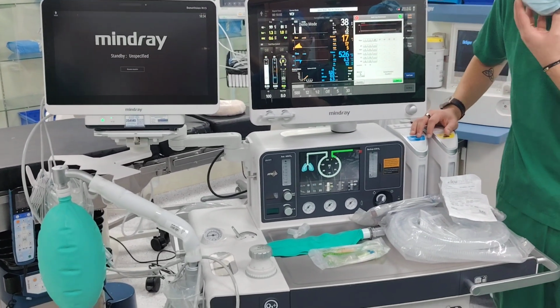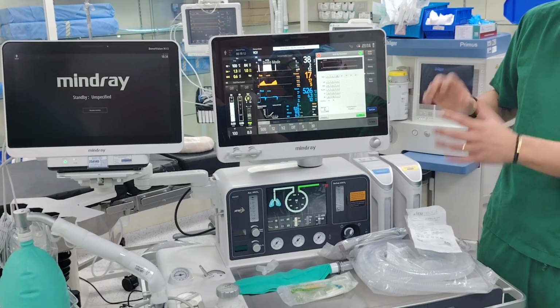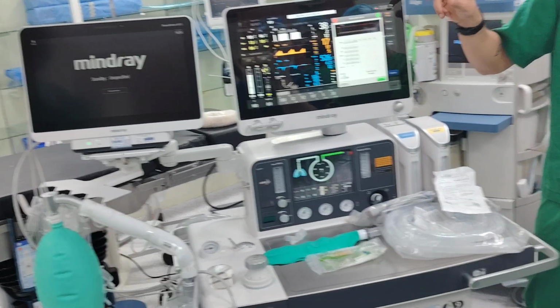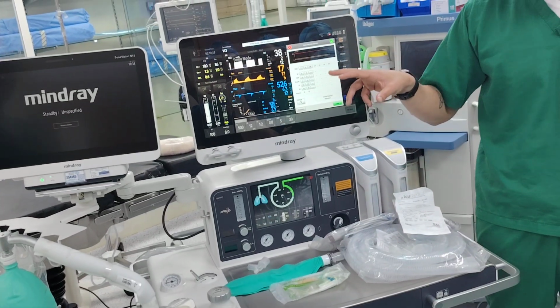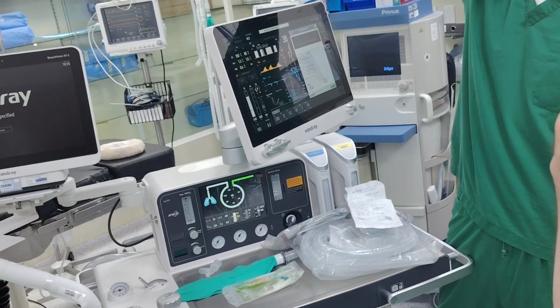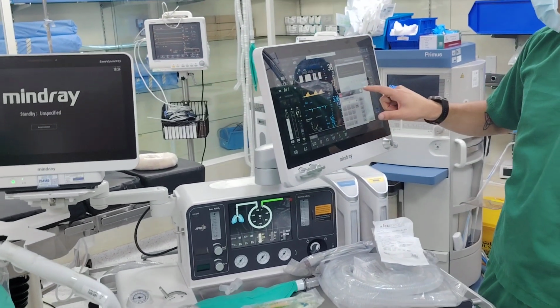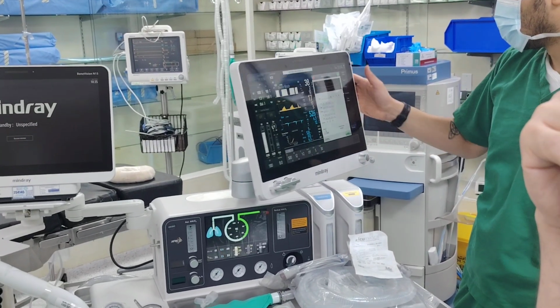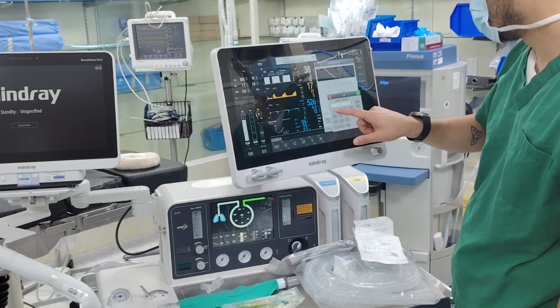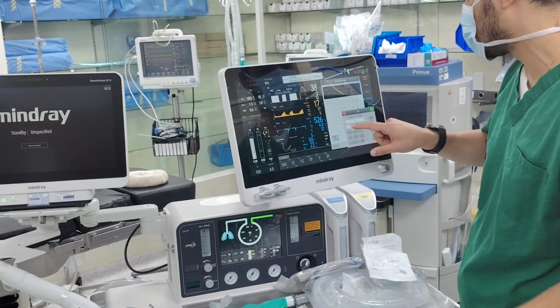What I will do, because this is to fill in, I'll make an example, save it as a profile. Okay, and then you can actually start to fix it or to adjust it accordingly. What I usually do is like this, because the best technique is going up slowly, going down slowly. So let me change it for you. So I put the driving pressure 15 to be fixed.